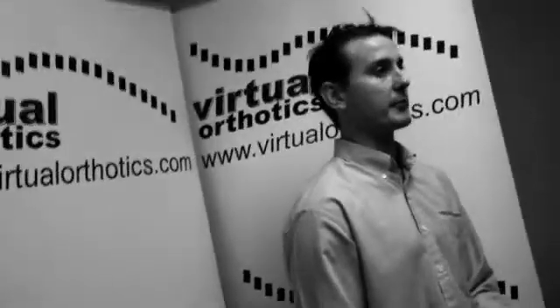Virtual Orthotics is a CADCAM orthotic laboratory that's been running since 1999. Today what we're going to talk about is the differences between a CADCAM orthotic lab and a traditional plaster-based lab. Plaster-based orthotic labs have been around for a number of decades now. There are a few manufacturing issues and a few inaccuracies with traditional plaster-based manufacture, and that's why CADCAM manufacture of orthotics has become so popular in recent years.